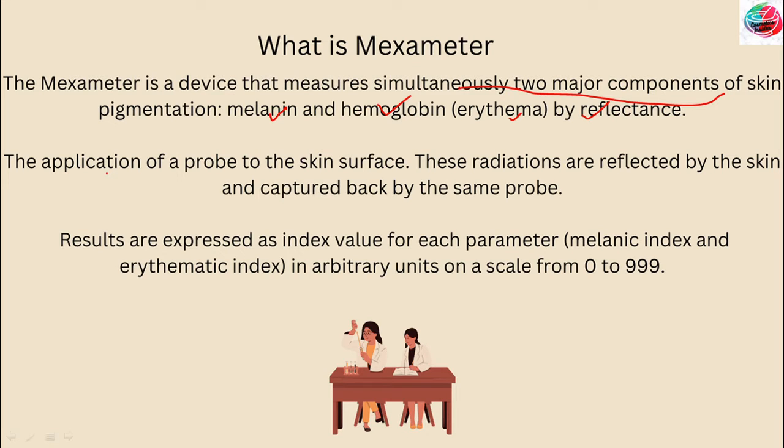The measurements are performed by the application of a probe to the skin surface. The probe has a 5mm aperture that emits radiations. These radiations are reflected by the skin and captured back by the small probe. The results are expressed as an index value for each parameter — melanin index and erythema index — in arbitrary units on a scale from 0 to 999.